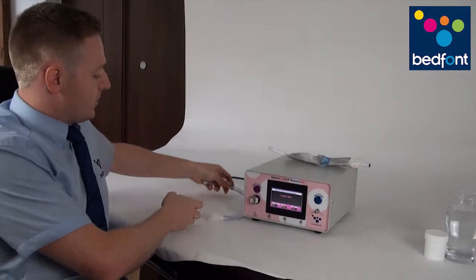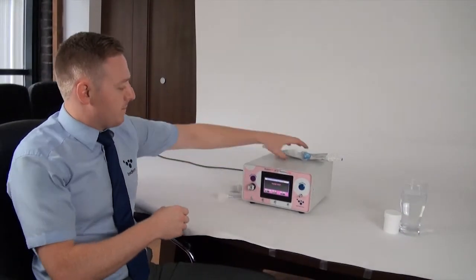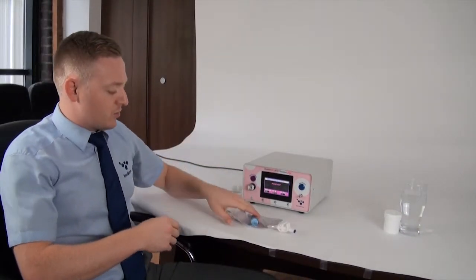So now we're going to go through the breath bag sampling. In terms of getting an end-tidal sample, it is actually easier to do the online direct breath sample with the mouthpiece because it gives the patient something a bit easier to aim towards.